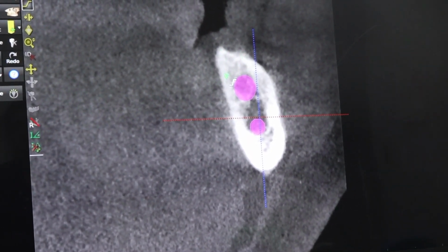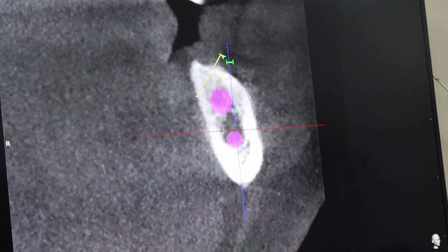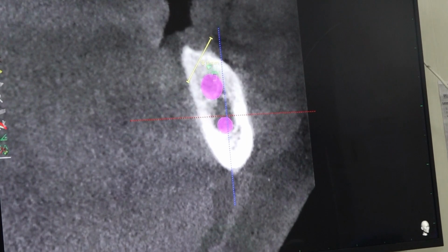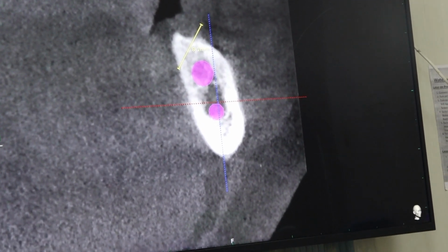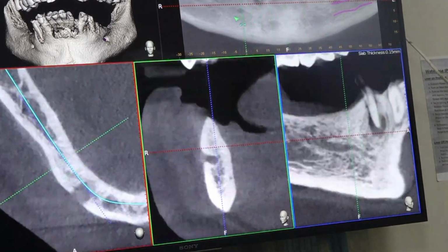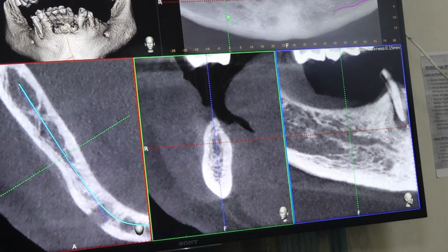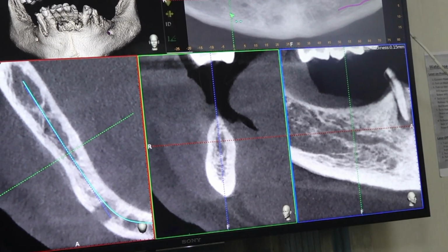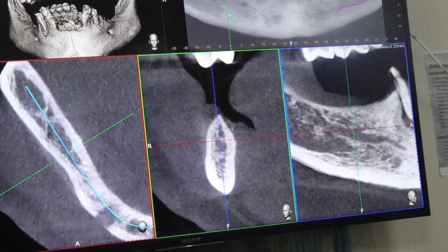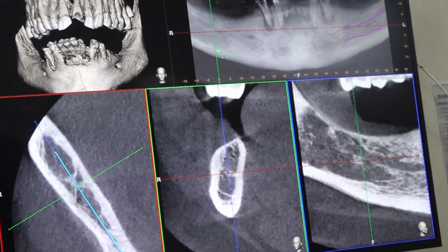Here you cannot do a lingual cortical engagement, the bone is very less, right? So using distal mandible on left side is out of question. The right side also, there is no significant mylohyoid ridge.